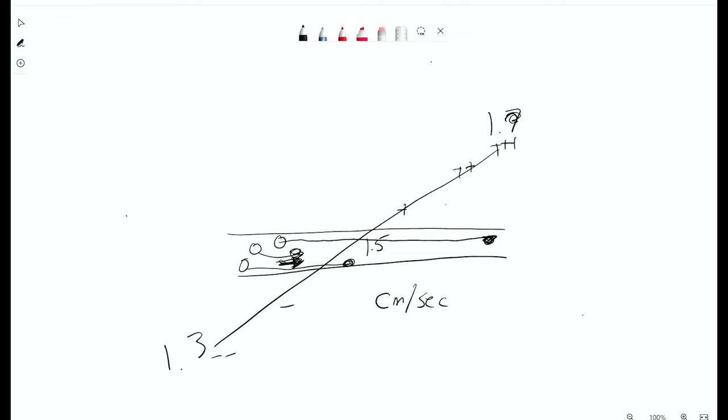Now, we know the gradient that we turned on. So you'll see that this one is going to experience this magnetic field strength all the way up to this magnetic field strength. So that means that around the clock face, it's moving really, really fast. You know what I mean? And so let's say there was stationary tissue, a proton out here that's stationary tissue. It's going to continue.